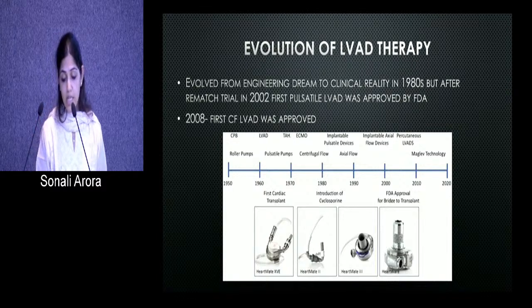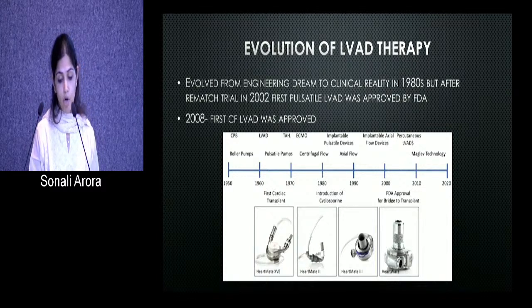So this is the evolution of LVAD therapy. It evolved from an engineering dream to clinical reality in the 1980s.